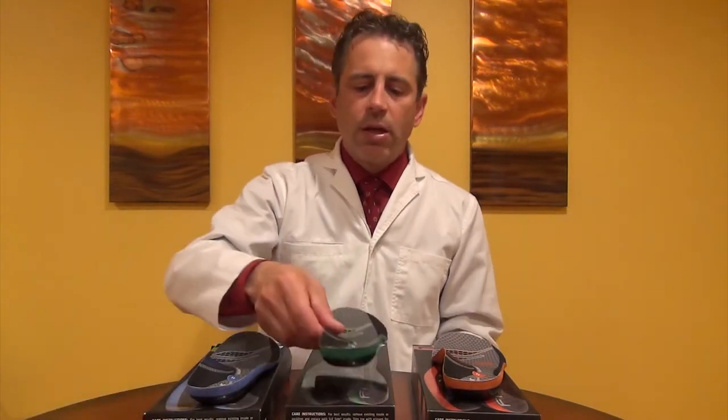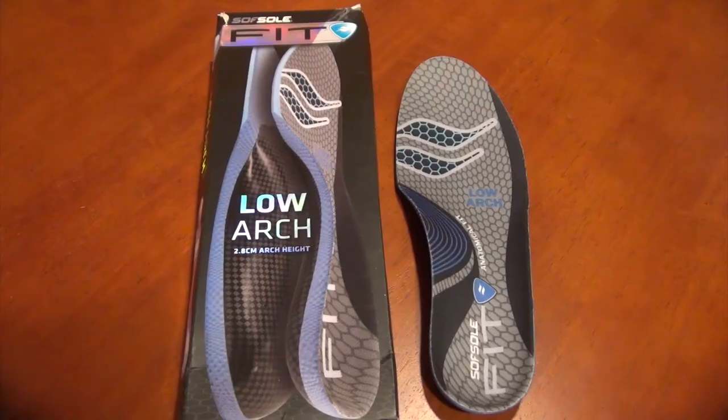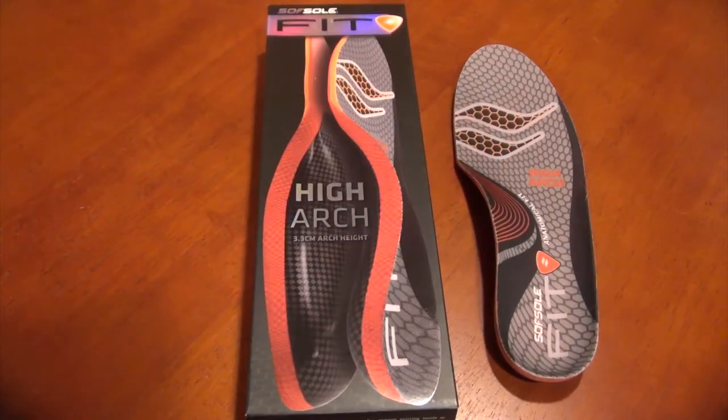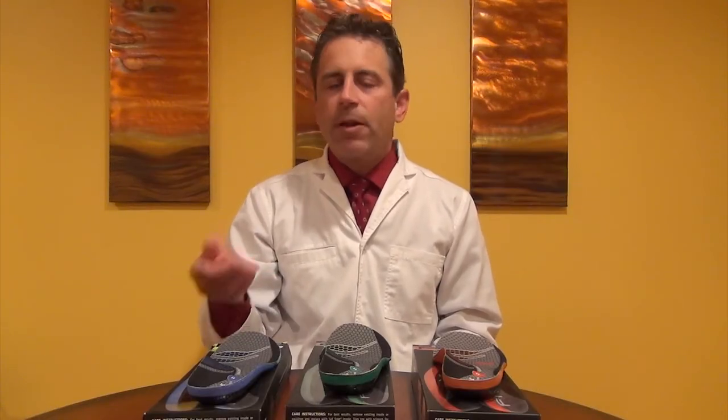This is an interesting arch support system. What SoftSole has done, they have created three different inserts: one measured for low arch, one measured for neutral arch, and one for high arch. On the box, they actually give you the measurement of the arch height. Very interesting.